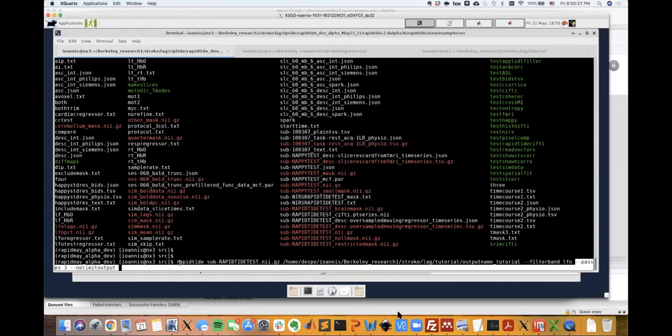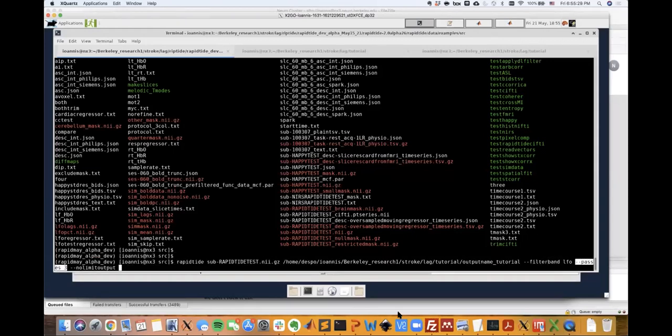The third argument, passes, is a specific option that directs rapidtide to perform the delay analysis 3 times. What does that really mean? Well, the idea is that rapidtide will create a new estimate of this initial global noise signal regressor by aligning all of the time courses in the data to bring the global signal in phase. Then a new regressor is going to be built by averaging these, and then the process continues.